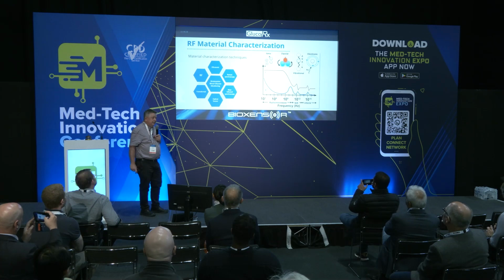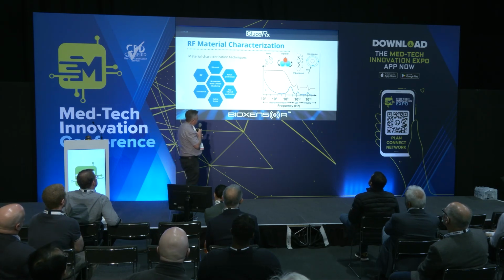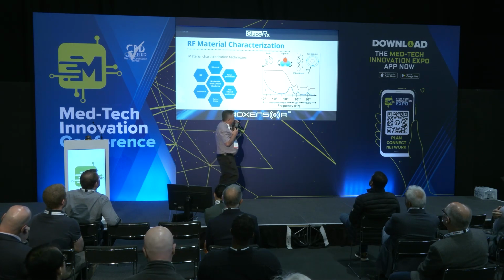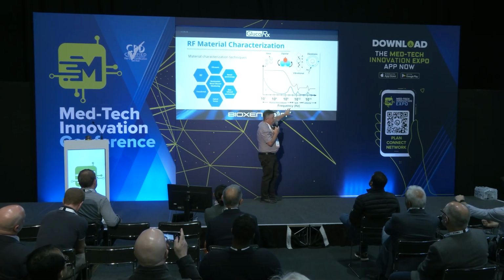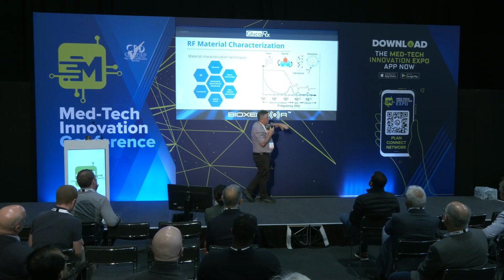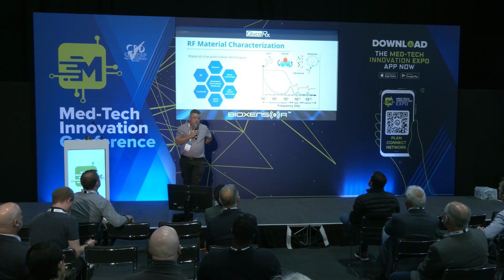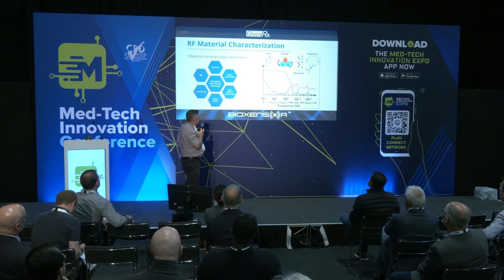Again, a little bit of techie stuff. This is what we're trying to target here. What we've got here is a plot of what we say is the dielectric spectrum of materials. So this goes all the way from radio frequencies through to infrared, through to visible light and UV. It's a log scale. And you notice there that there's all sorts of blips going on. Those are different sorts of mechanisms that we can target with that red bit of the electric field.